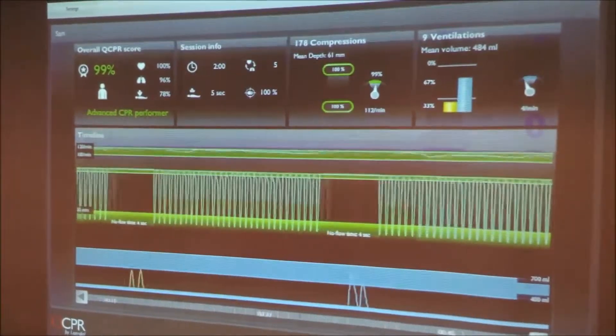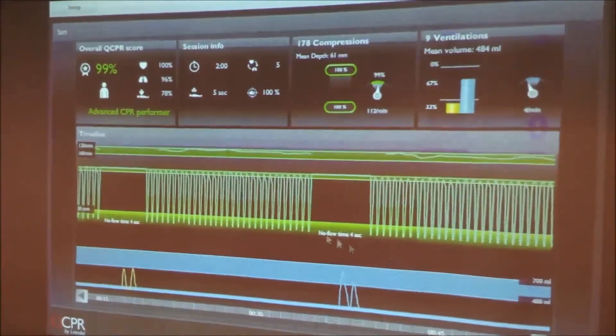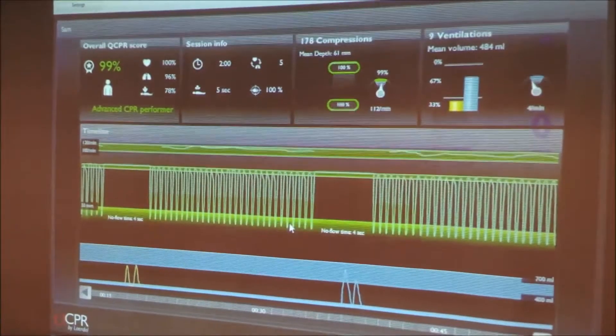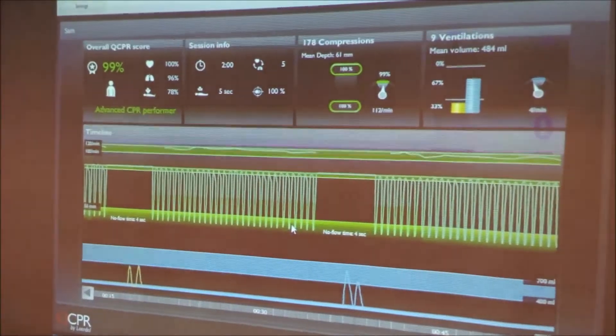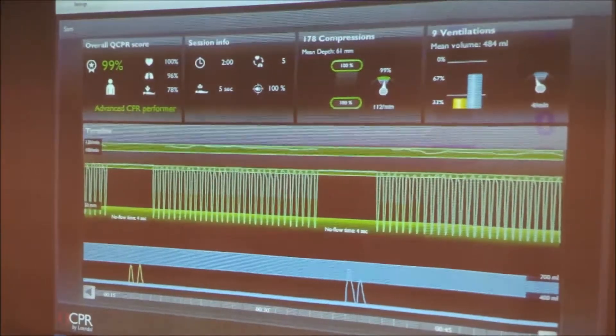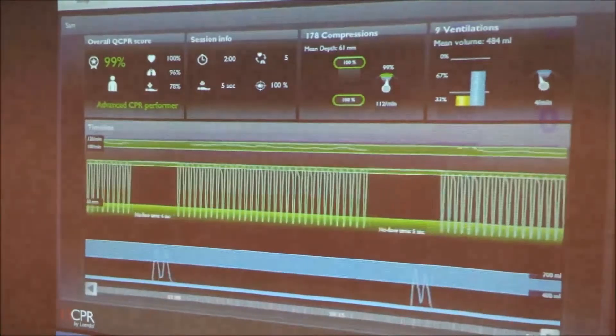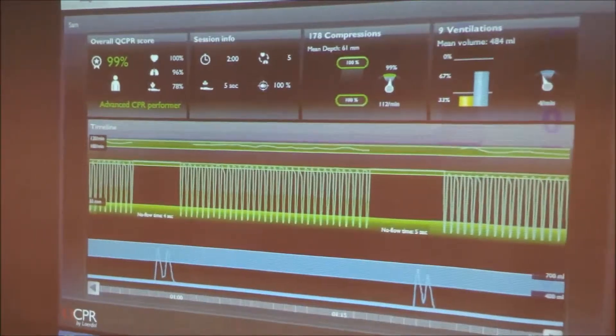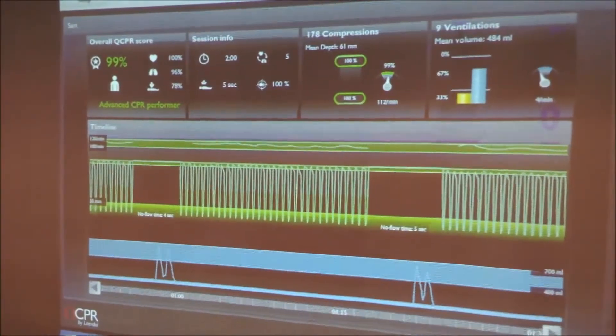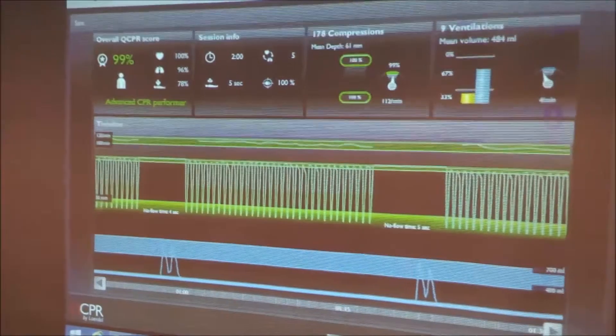And I'm going to move the data on because we can see here all the compressions, the 30 compressions, and then we get to 2 ventilations. And if I move it on again, we'll see more compressions and ventilations, and that mean no flow time of 5 seconds.